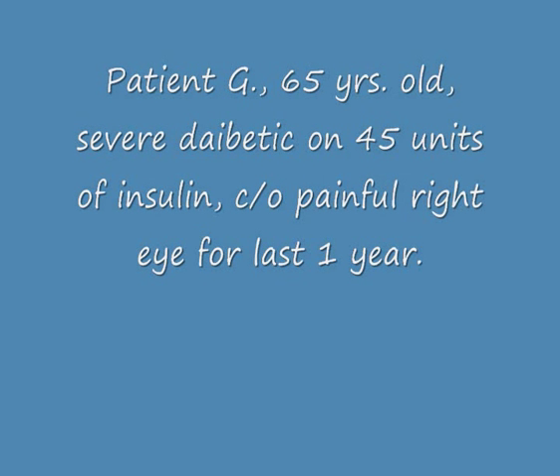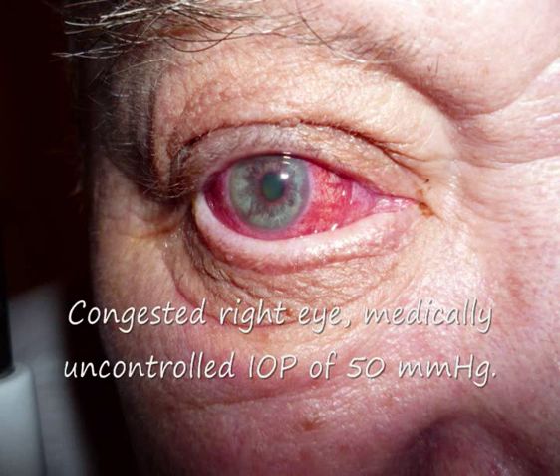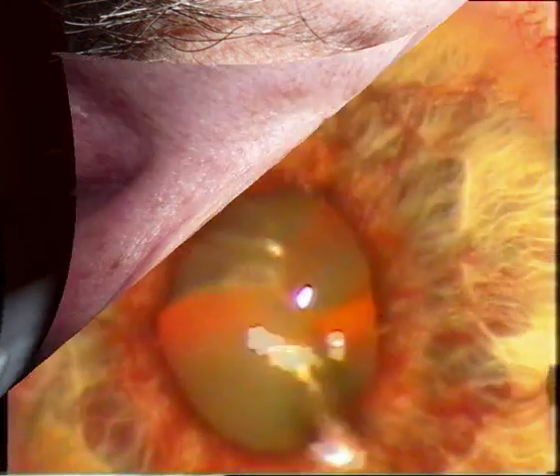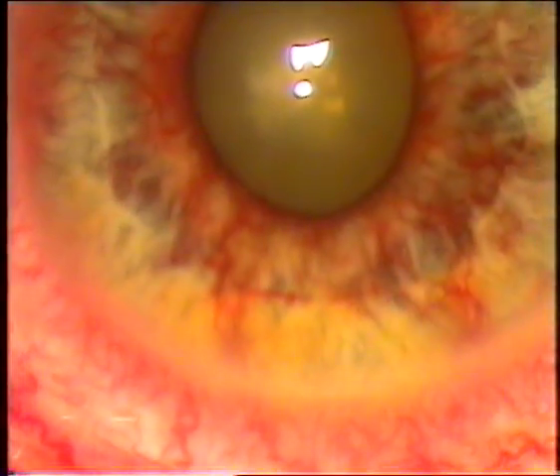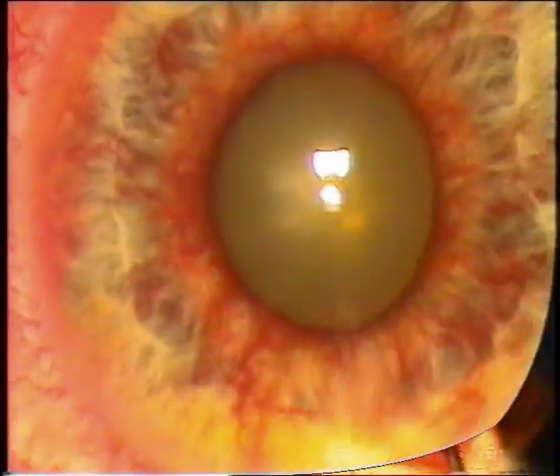This is a case of a diabetic patient, 65 years old, on 45 units of insulin, complaining of a painful right eye for the last one year. The general outlook of the patient before operation shows a congested right eye; IOP is medically uncontrolled at up to 50 millimeters of mercury.